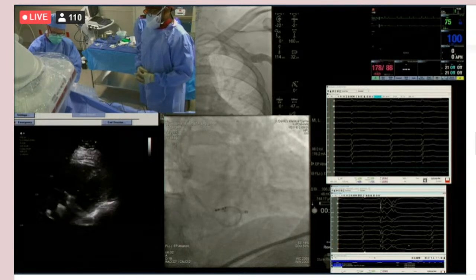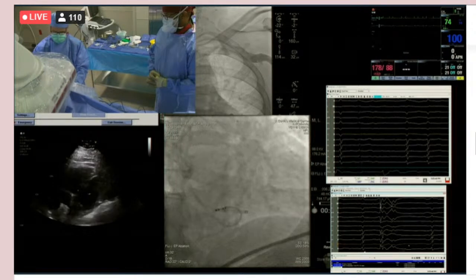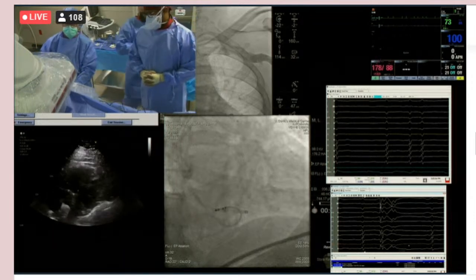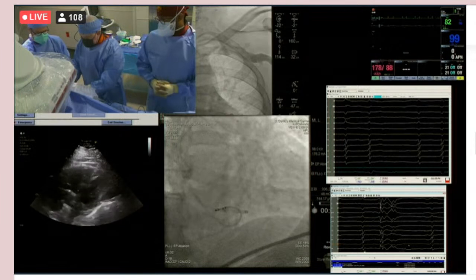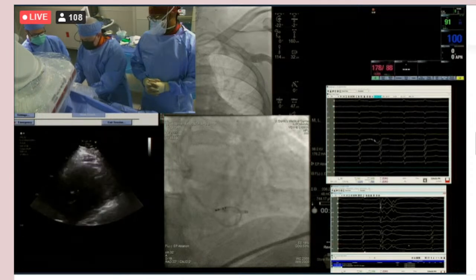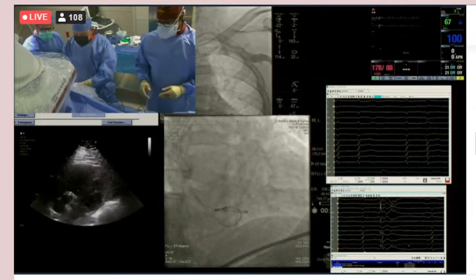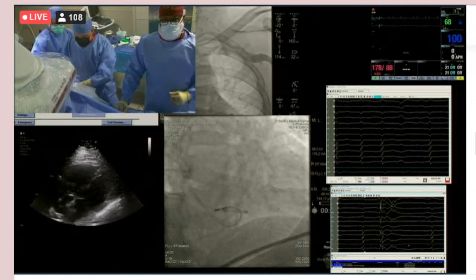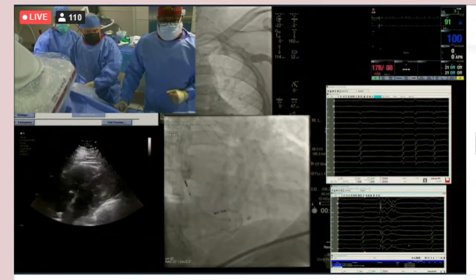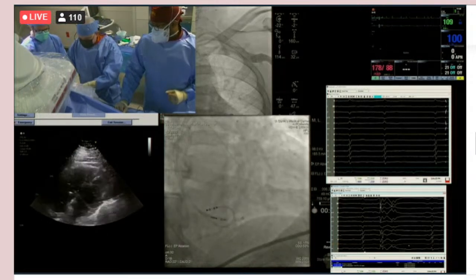Yeah, I've seen some companies promoting their larger catheters with these retractable helices, and I had mixed feelings about it. Having an extendable, retractable lead has obviously some advantages. At least it'll transmit torque better. To me, that's useful. But if you do go all the way through and you have a 7 French hole in the septum, that may be more hemodynamically significant than this little 4 French thing. I just don't think this is going to be a problem if you go all the way through and have to start over.